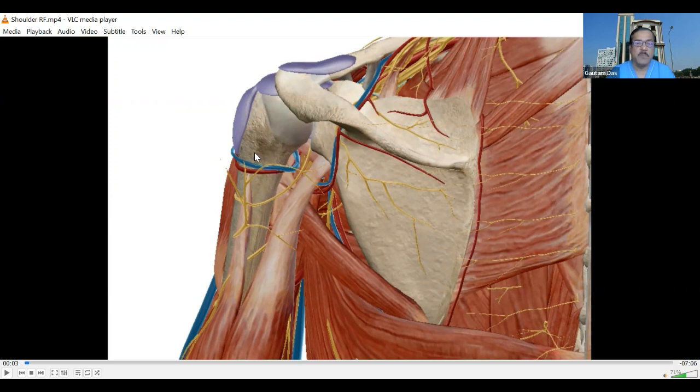The second important target is the articular branch of the axillary nerve. The axillary nerve comes through the quadrangular space and then gives off muscular branches. At the lateral margin, it goes to supply the shoulder joint. If we target the axillary nerve here, we can avoid muscular weakness. We follow the posterior humeral circumflex artery, which accompanies the axillary nerve, moving gradually from medial to lateral. When the humerus shaft is no longer seen, we target the posterior lateral margin of the humerus.